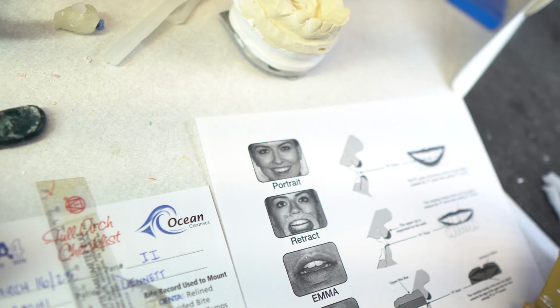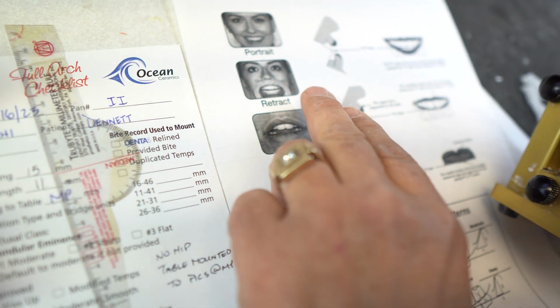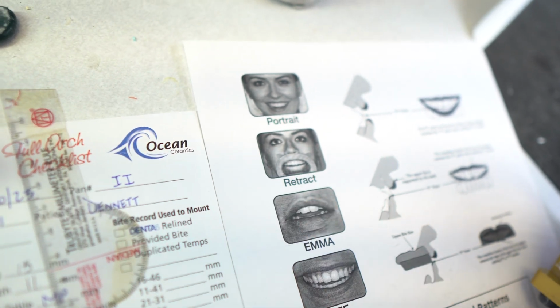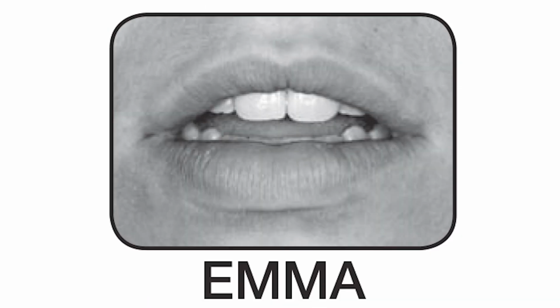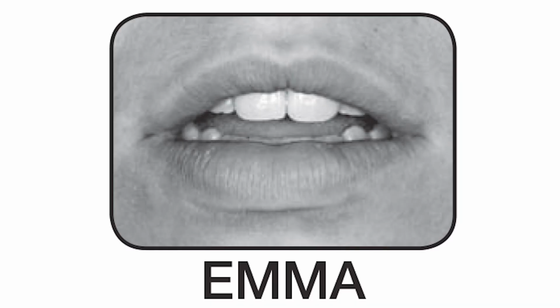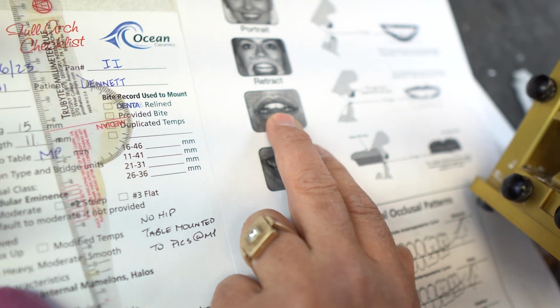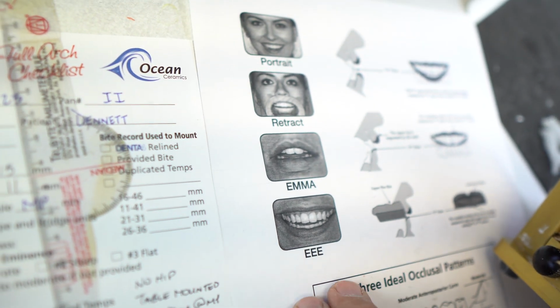in analyzing how the smile line is. We want to see what the occlusion is by retracting it. And more importantly, from these images, we want to make sure the pupil plane is level with the occlusal plane. And then, of course, the EMMA, most doctors and or techs aren't aware how key that is. On a man, normally you'll have 1 to 2 millimeters display, pronouncing EMMA, or less, but 1 to 2 looks natural. On a lady, it's 2 to 3, sometimes more, depending on the youthfulness or the physiology.